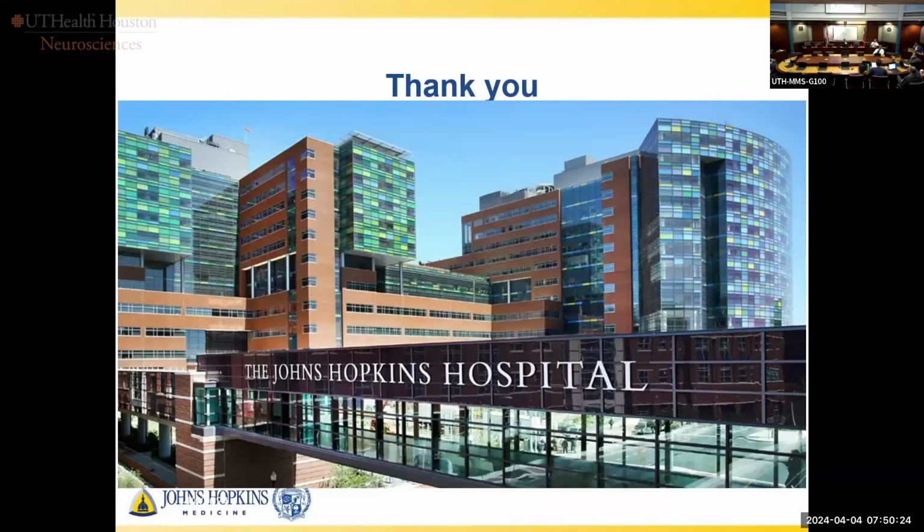But I can tell you that Nick has a certain type of intuitive skill, if you will, in working with the robot. He knows when the robot's off, but there are people that don't. And the robot can be off. We've seen cases where, not necessarily our own, you have a small shift in that registration marker, or something gets shifted, and you've got one screw in the canal and one screw 3 centimeters outside of the pedicle. And there's some people that don't know that because they've never spent the time to place pedicle screws.